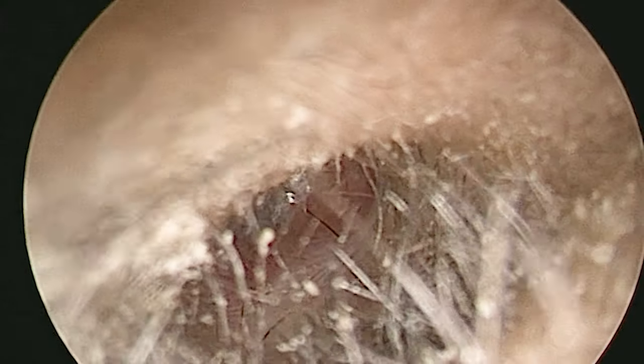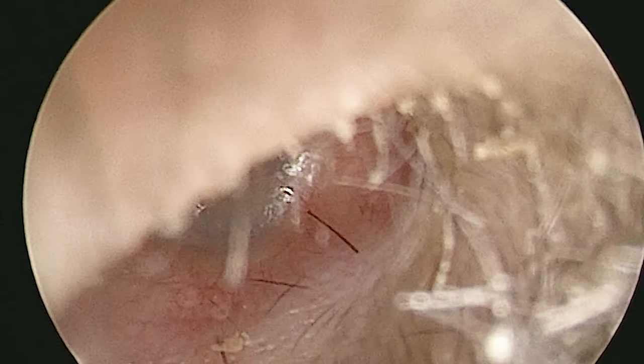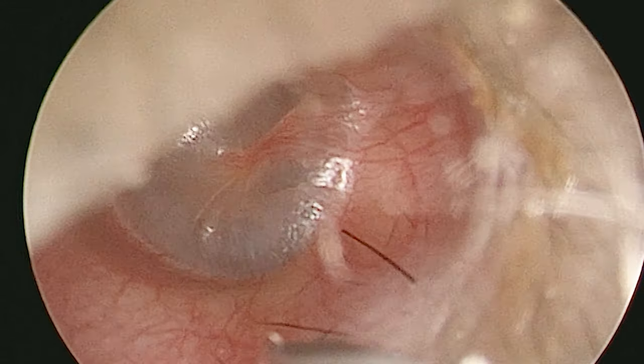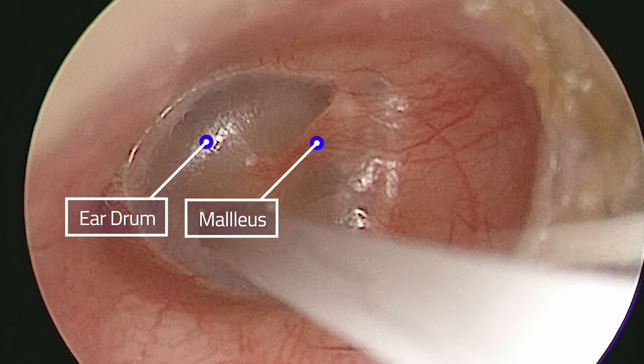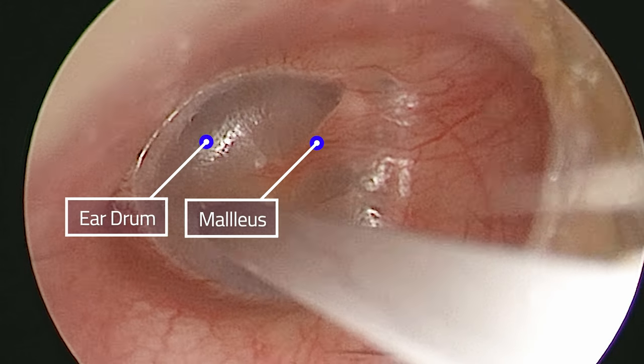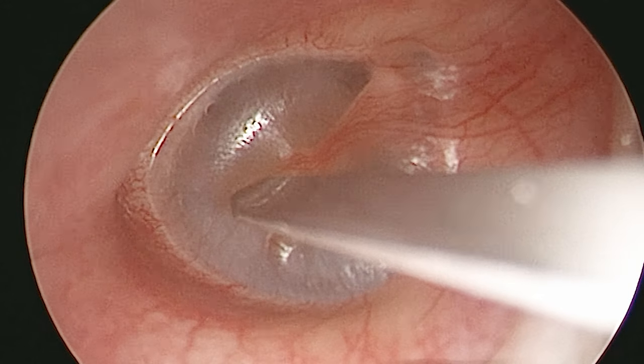So let's get on with it. This is the ear hole, and coming to view now is the knife used to make the hole in the eardrum. For scale, it's about two or three millimetres across. In the background you'll see a thin membrane which is the eardrum, and the bone of hearing attached to it called the malleus.